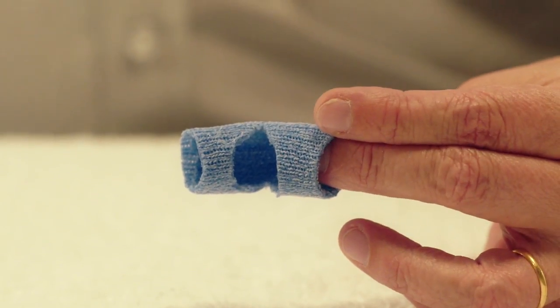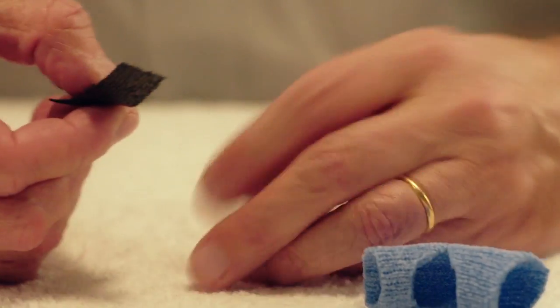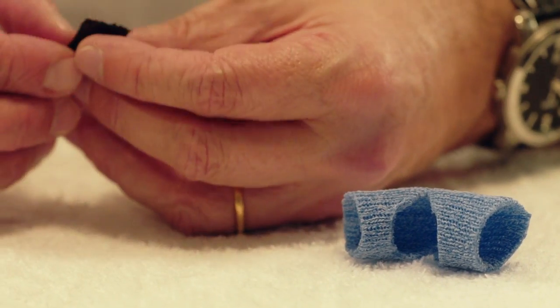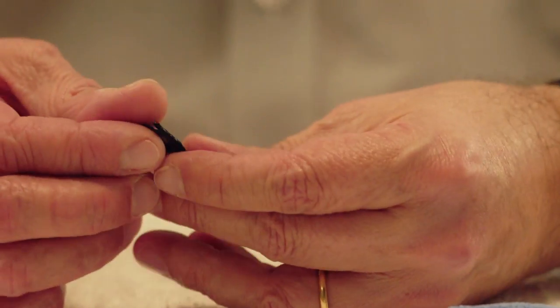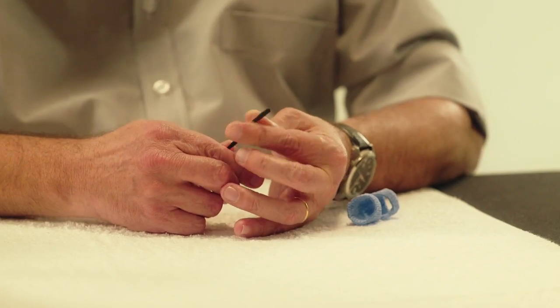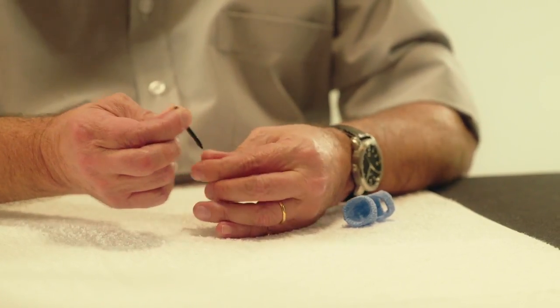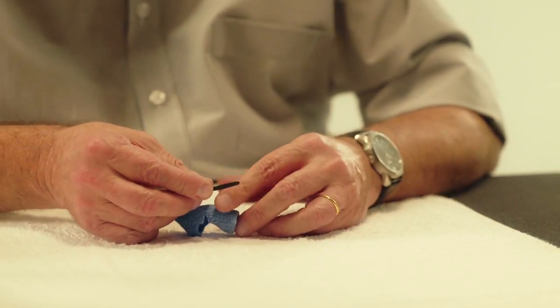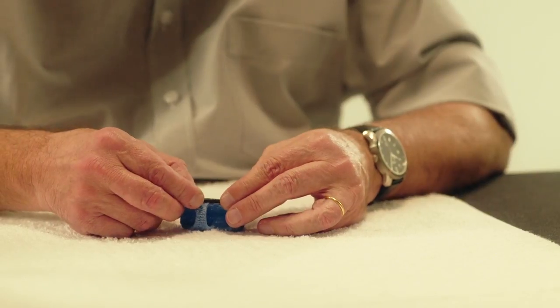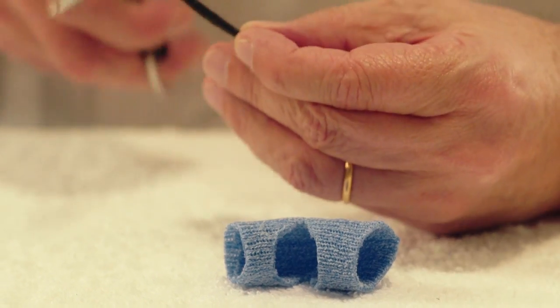To make the first of a pair of hinges, take the smaller piece of Orficast. After heating, roll the Orficast on itself while exerting a firm pressure on the complete length of the Orficast. Measure the length of the hinge and cut off the excess length.